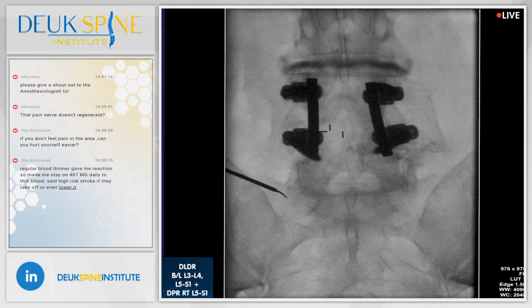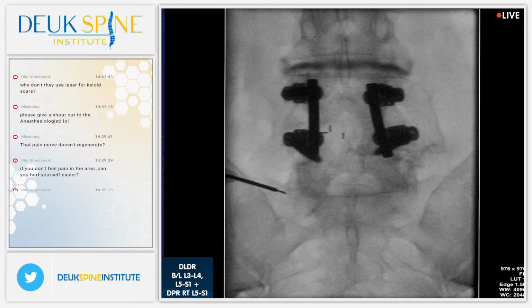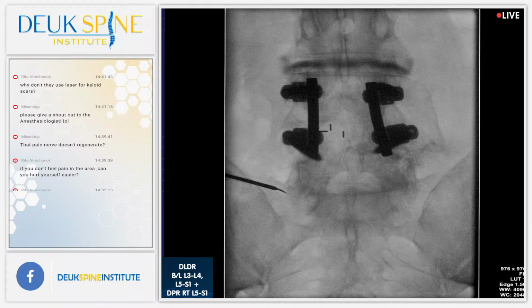What we do differently is we deliver more energy called plasma, which RFA doesn't deliver. But also we move the tip around to be sure to get that nerve. Shot. Otherwise, it would regenerate. Shot.